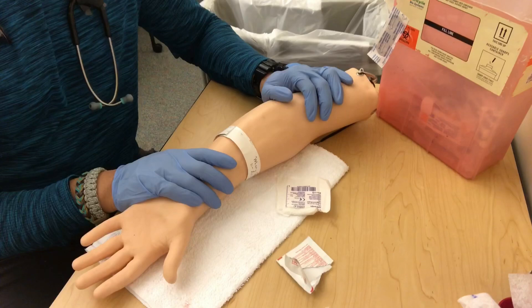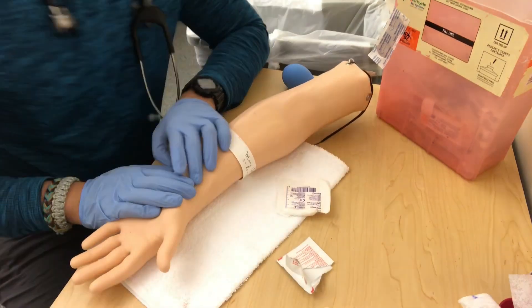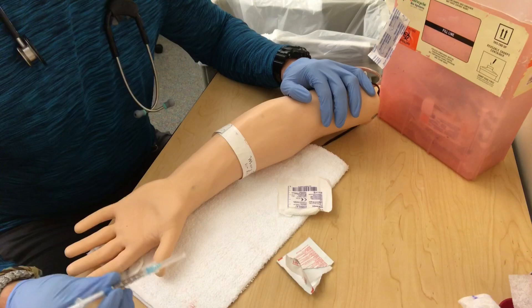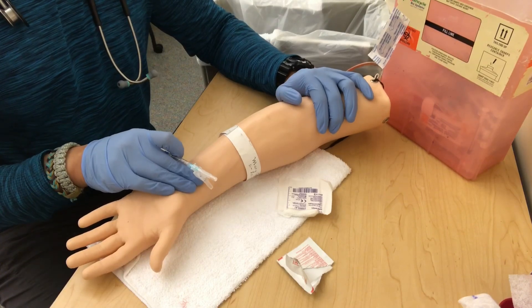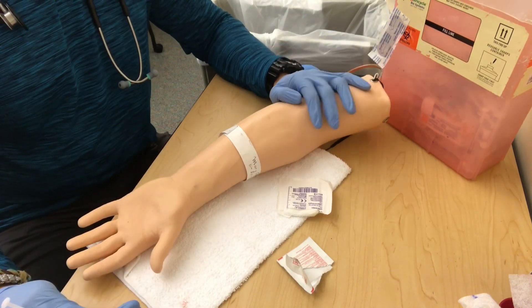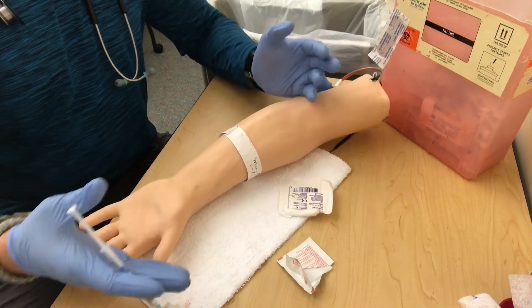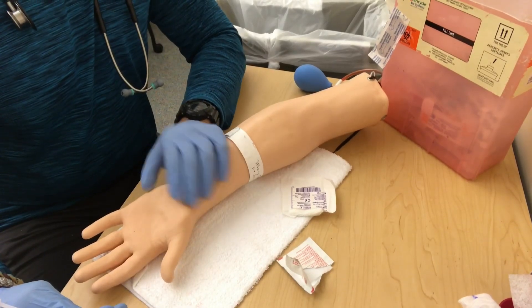First thing I'm going to do is position myself where I'm comfortable. A lot of RTs will bend over into weird positions — instead, use the bed adjustment and raise or lower it as needed. Get the arm in the right spot so you're comfortable. Treat this like an invasive procedure — the same way doctors set up for a central line, getting comfortable, things out of the way. Take ABGs seriously. Don't just poke wherever you're leaning.